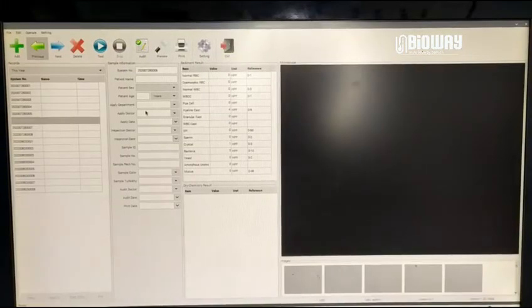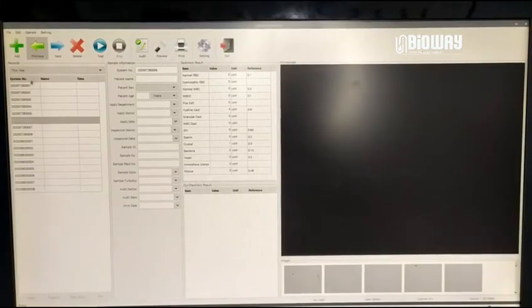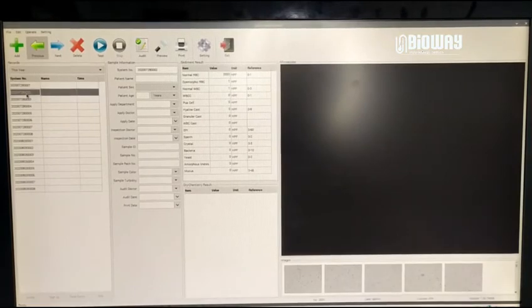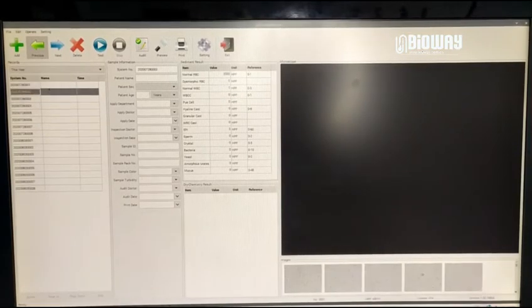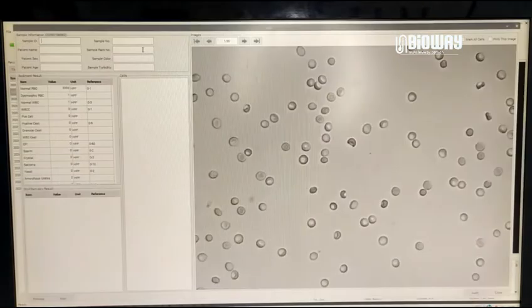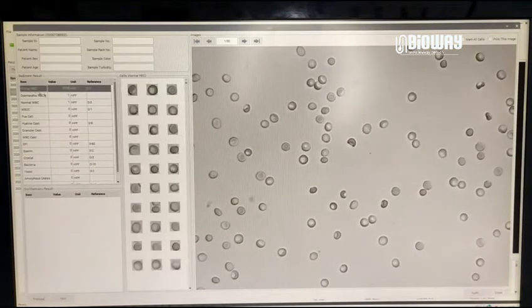In the record bar, you can choose any record that has been made. Click audit, and then you are able to check the details and images.